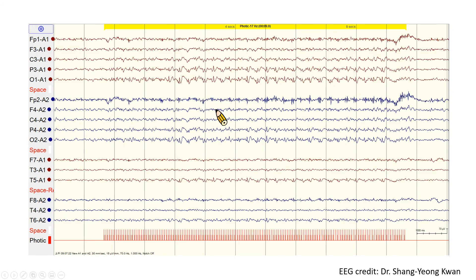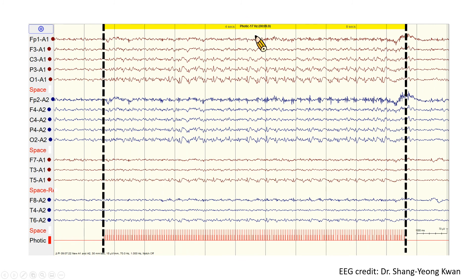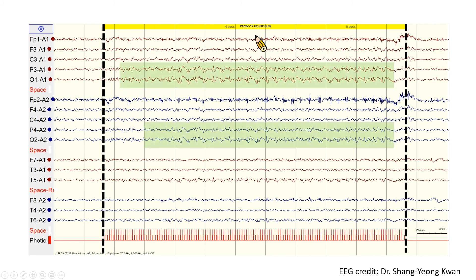This is an A1-A2 reference montage EEG. Between dashed lines is the flash stimulus trial of 17 Hz. We can see photoparoxysmal responses shown as spike and wave complexes, starting in the bilateral occipital region with secondary bisynchrony. We can see there is no time-locked relationship between the photoparoxysmal response and flash stimulus — the onset and cessation of the photoparoxysmal response show no temporal relationship to the flash stimulus.